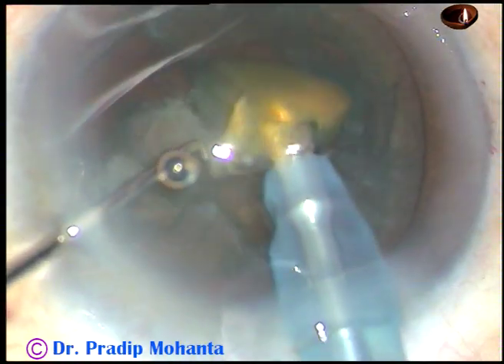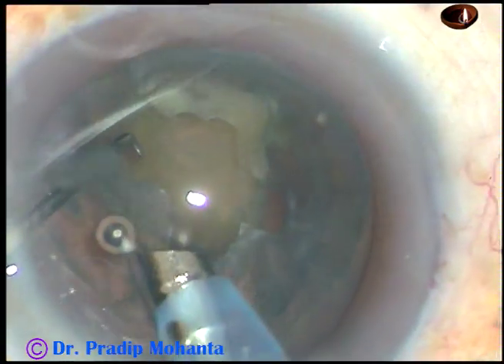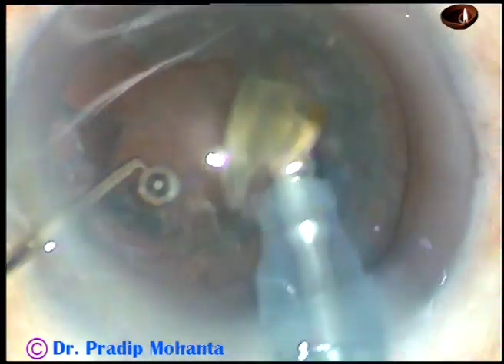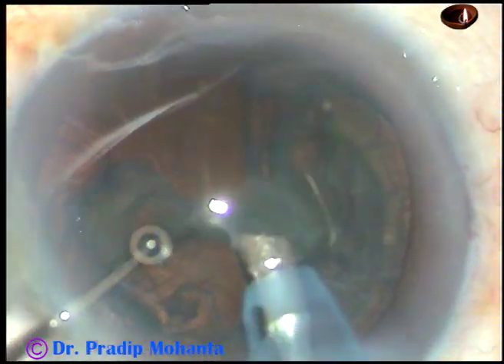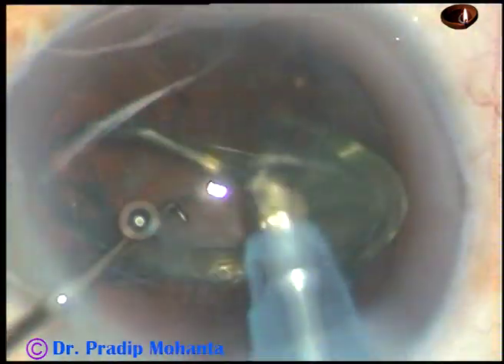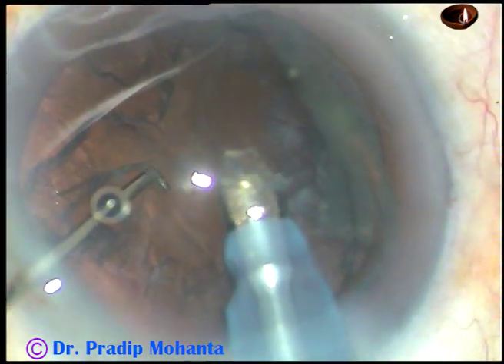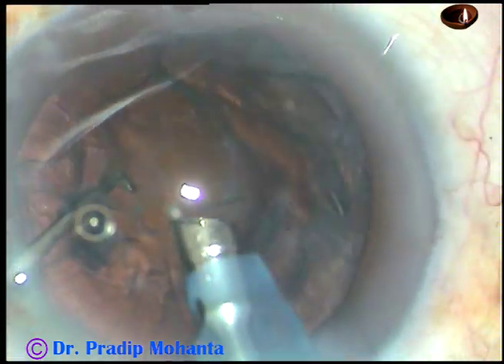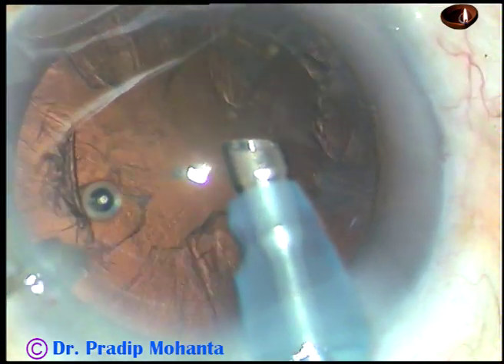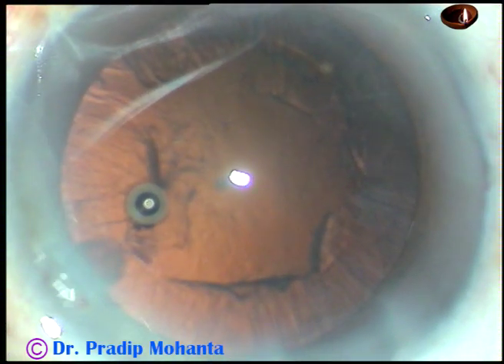So in soft cataracts, if you use very low vacuum, you can make the nucleus stable and use your chopper to slice the nucleus into several parts. Now the epinucleus is removed. This is the epinucleus — and that's it, the nucleus and epinucleus are managed.